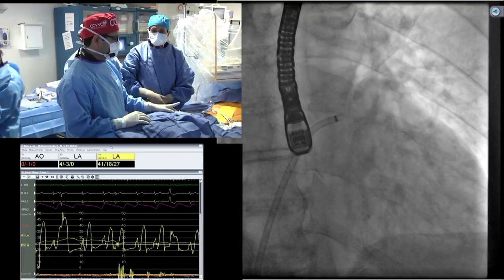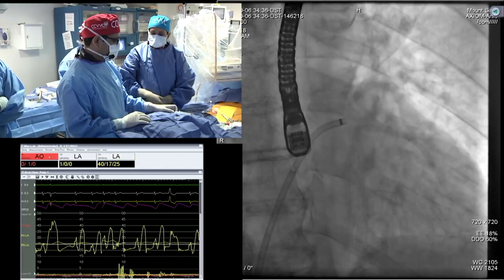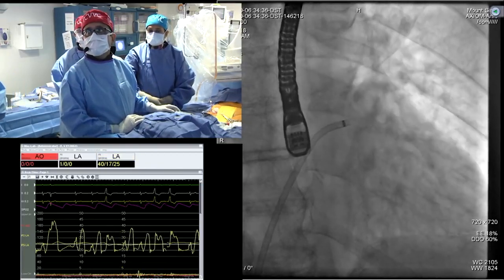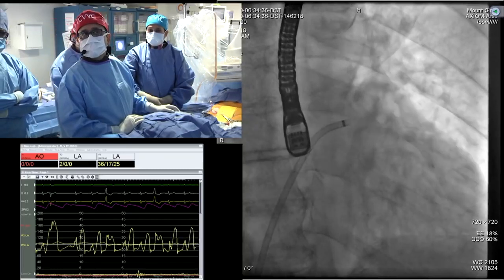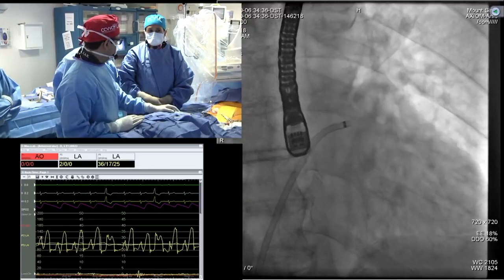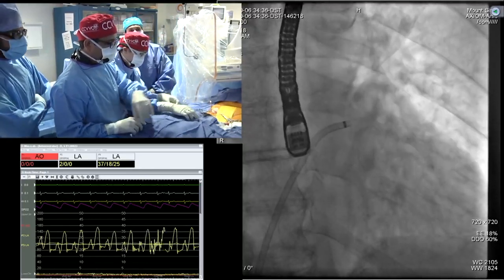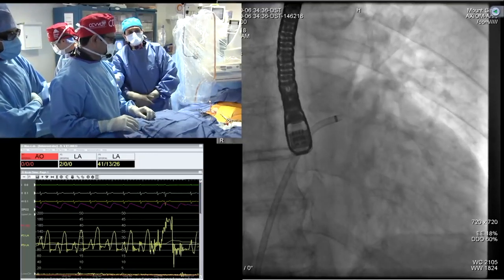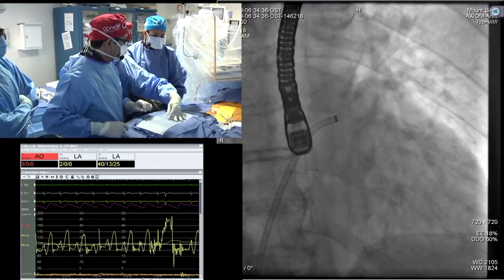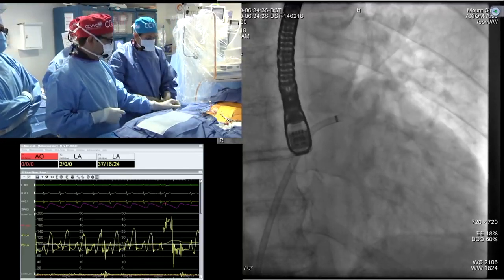That one, because of the radio-opaque tip, the echo, you are able to see how your transseptal catheter and needle move. Once you are at the right spot, you don't have to do anything; it's atraumatic. When you think it is right, you just do your zapping and you're able to cross the transseptum. Is our height good, right, Gila? Yep. Good.